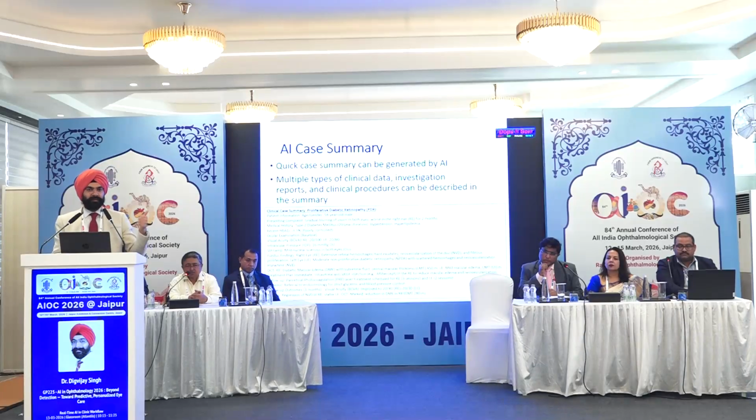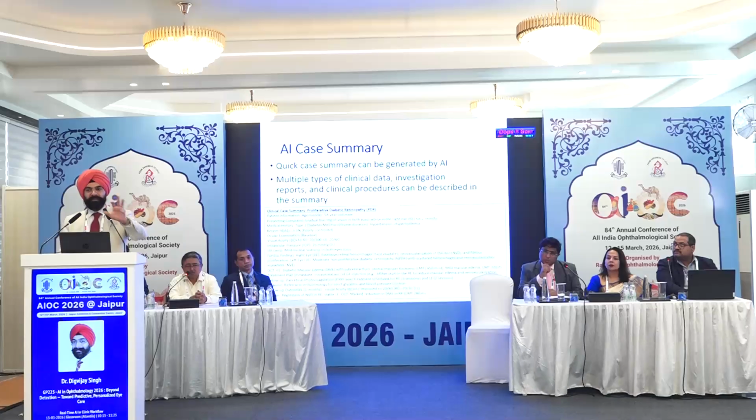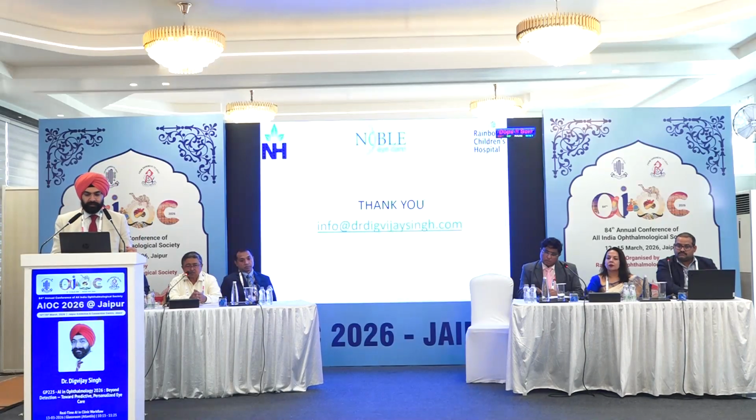I'm just saying we did a YAG PI on so and so date. After that, it will automatically recognize that the IOPs after the YAG PI were this and this and this, and it will mark that there because it's intelligent enough to know that.